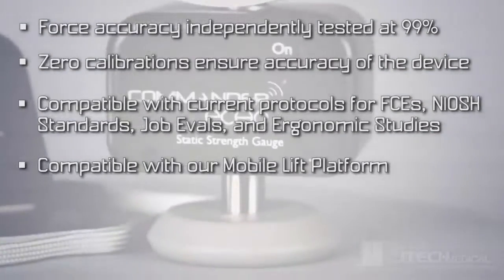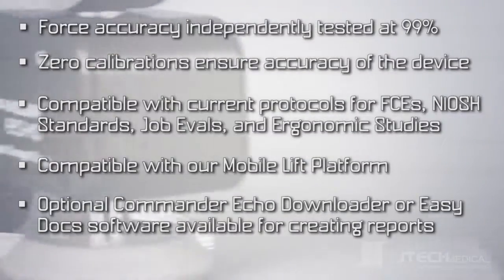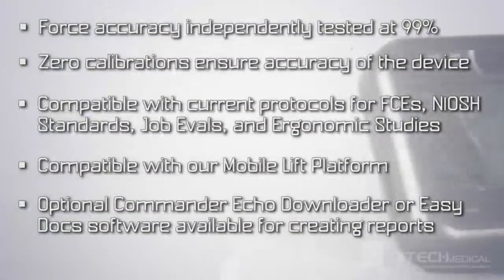JTEC's mobile lift platform is an optional accessory. It's also compatible with Commander Echo Downloader or EZDoc software for creating reports.